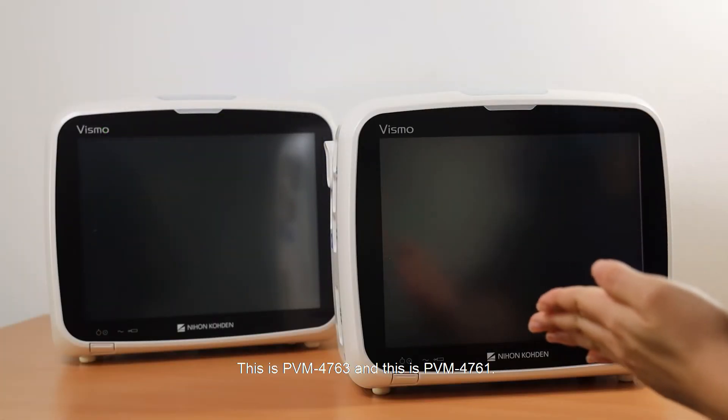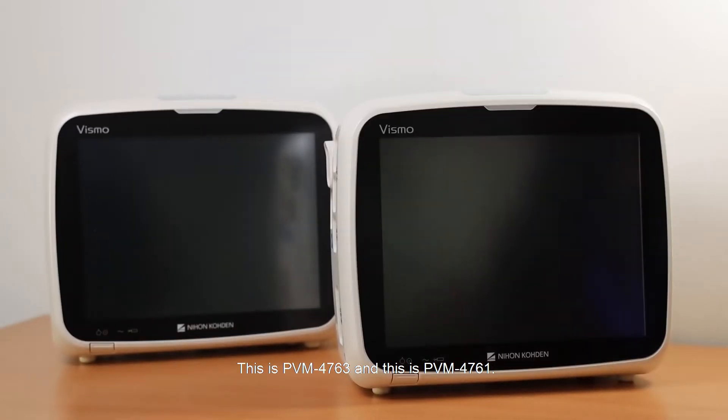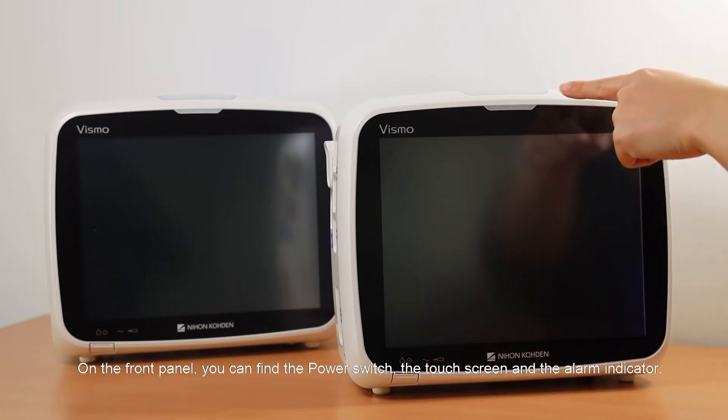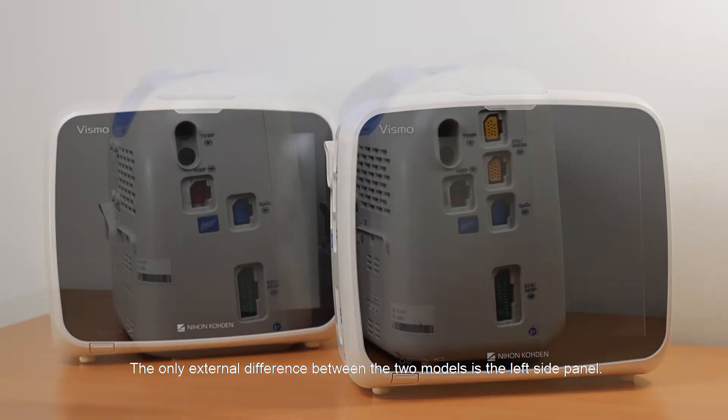This is PVM-4763 and this is PVM-4761. On the front panel, you can find the power switch, the touch screen, and the alarm indicator. The only external difference between the two models is the left side panel.